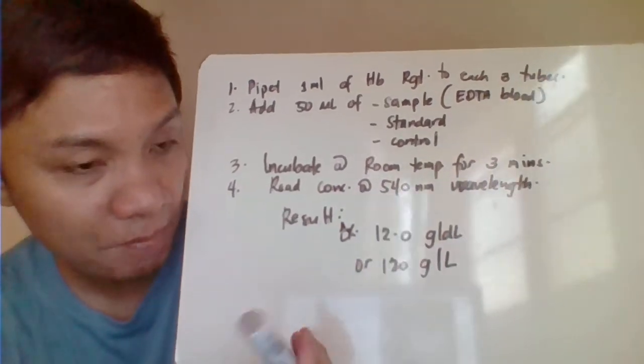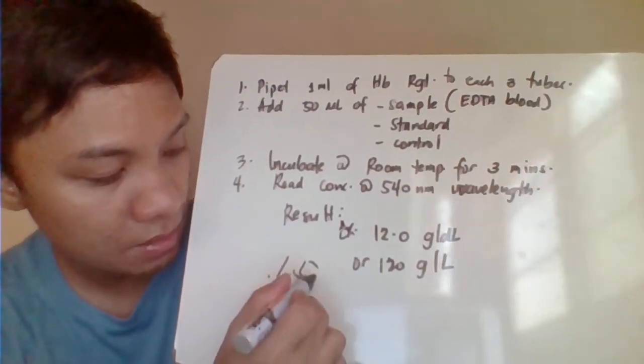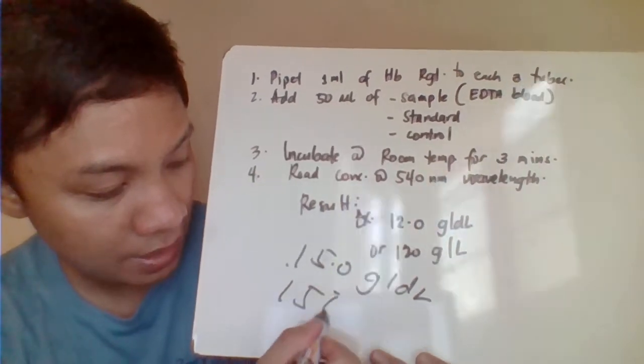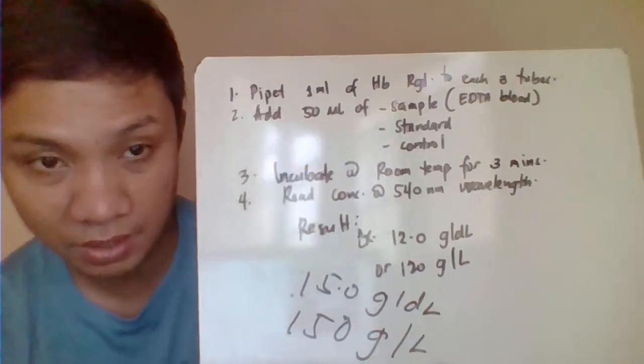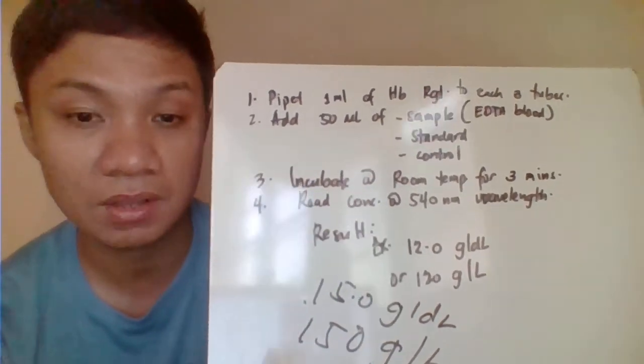So, for example, if you have 15 grams per dL, this is equivalent to 150 grams per liter. That's how you're going to report your hemoglobin concentration. Okay, thank you.